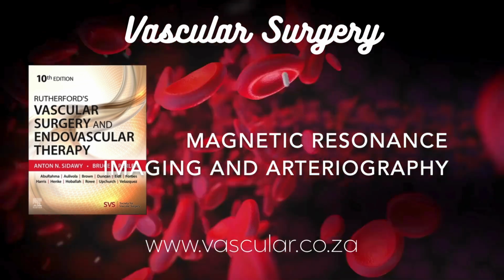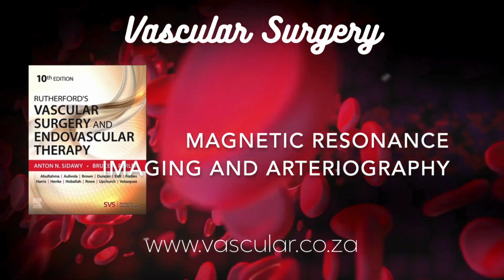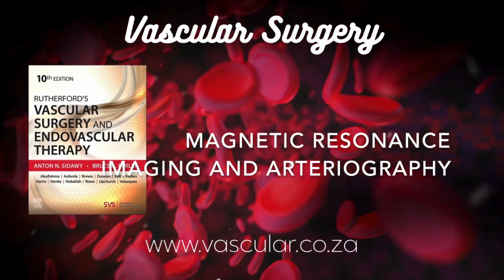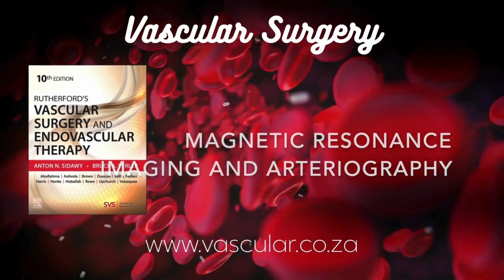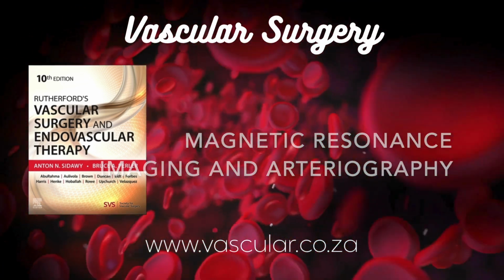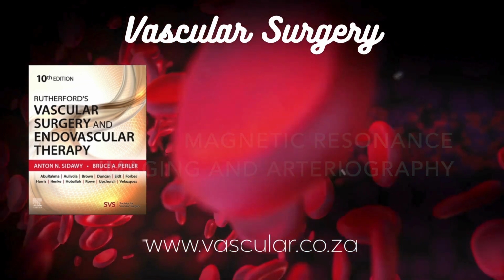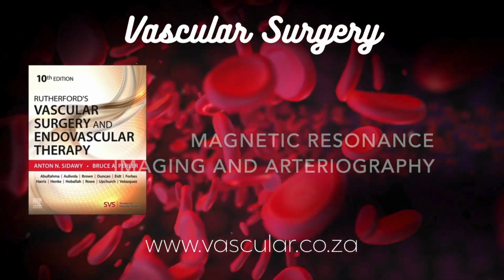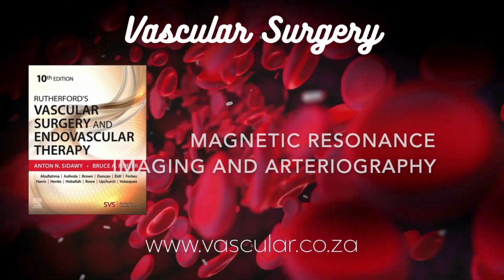But, like any tool, MRA must have its limitations and risks. Let's talk about those. Scan artifacts were mentioned. What kind of things can go wrong with the images? Yeah, artifacts are definitely something radiologists watch out for. One example. In the chest, the techniques used to suppress the bright signal from fat. Fat saturation. Right. Sometimes, if a blood vessel is right next to the lung, that fat suppression can accidentally suppress the vessel signal too, making it look falsely narrowed or blocked.